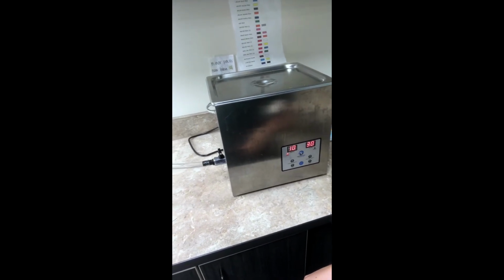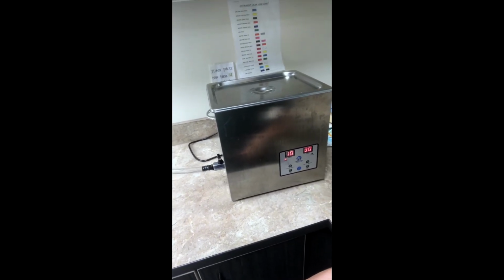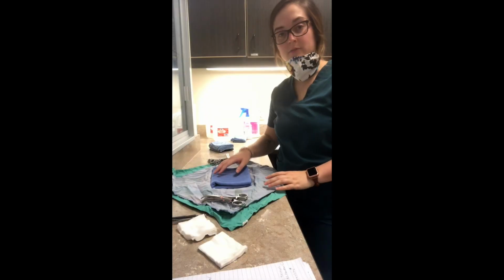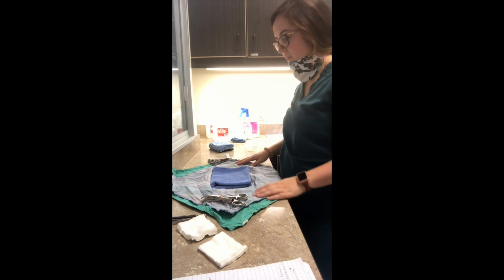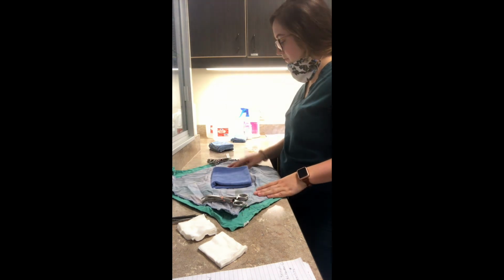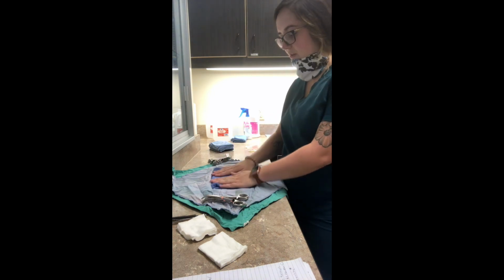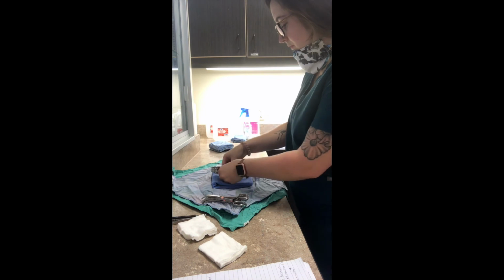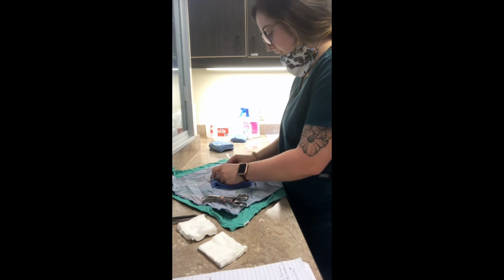And now it's going. Then we'll come back and rinse these off, and they'll be ready for a pack. I'm going to demonstrate how to wrap a pack. So we have our 2 wraps here that are already out. I have my instruments that I'm going to lay on top of a blue towel. Put my instruments on the towel.